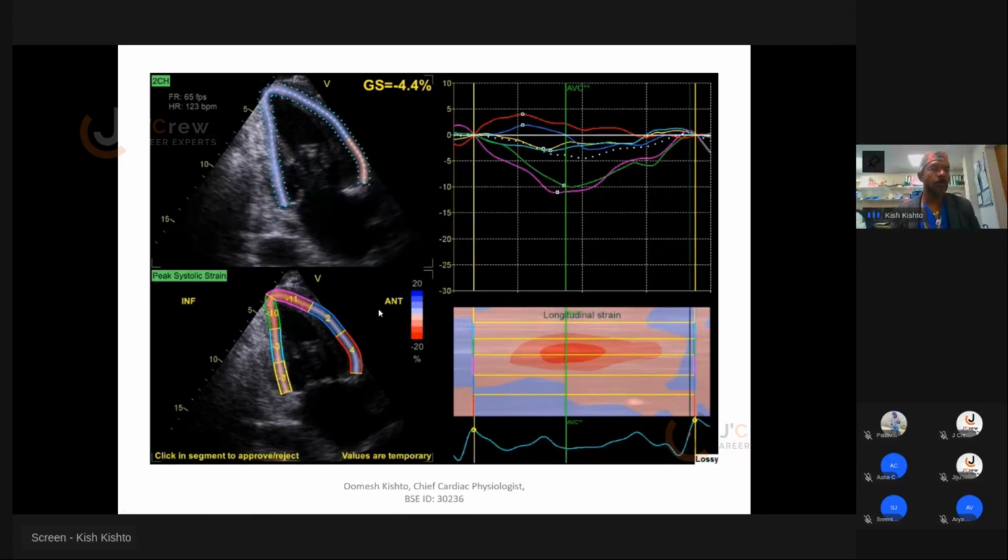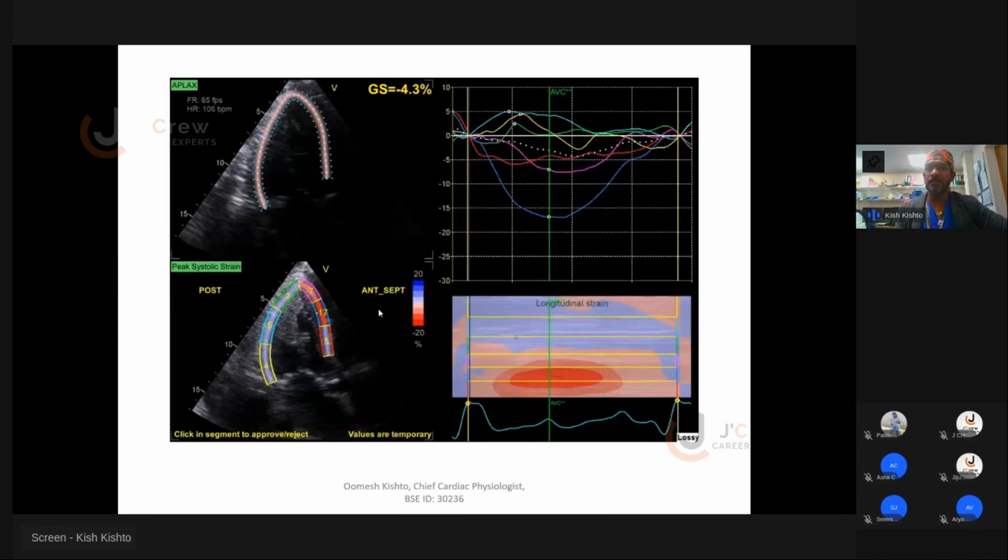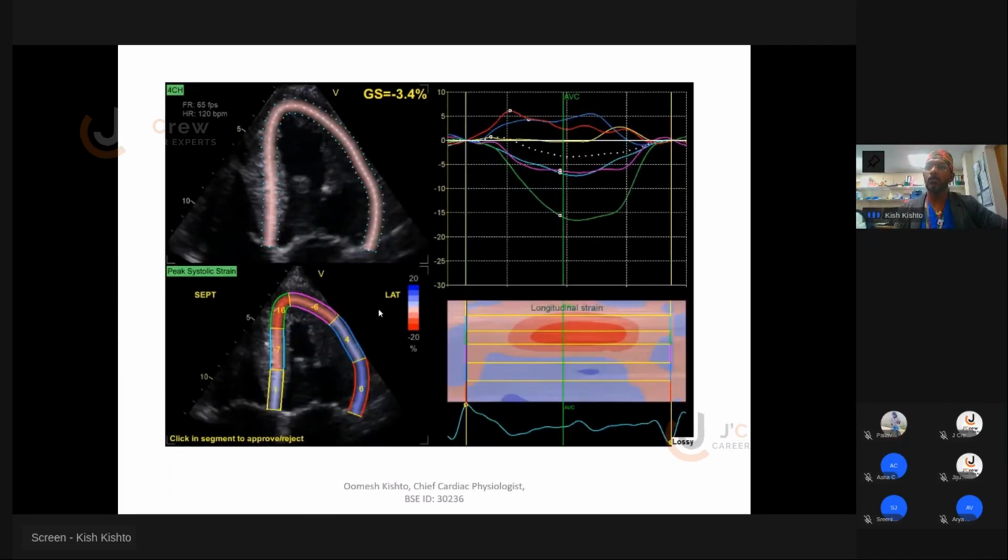So again, to assess cardiac amyloidosis, all these are part of your minimum data set. So by using all this data, except the one which is extra, the GLS, which we've done extra, the rest you should be routinely doing, all of this minimum data set, to help you get a diagnosis from your imaging.